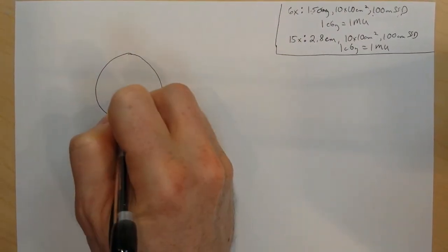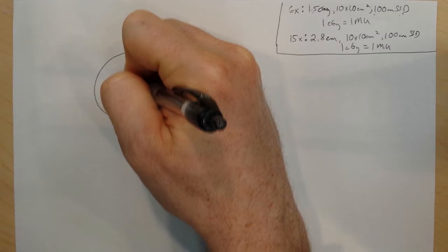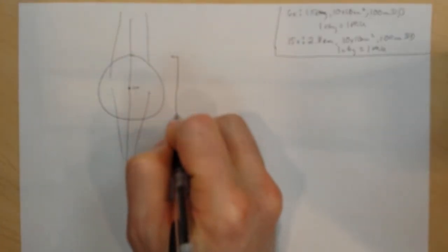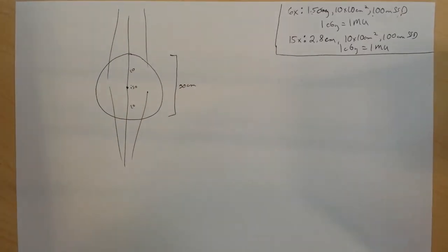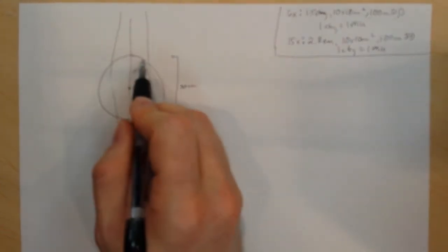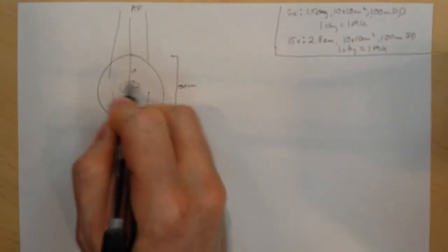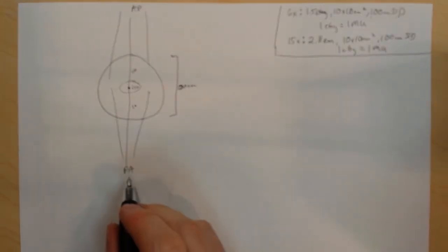So example 1: I have isocenter in the center of my patient, and I have AP/PA fields. Patient thickness is 20 centimeters, which makes each of my depths for my beam 10 centimeters. Most of the time we put isocenter midplane, because that way we don't get any sort of magnification between the jaws. Field sizes are defined at ISO, so my field size for my AP and my PA should be the same since my target's located at isocenter. This makes the dose calculation easy. This makes reviewing port films easy. Jaw sizes will be the same.